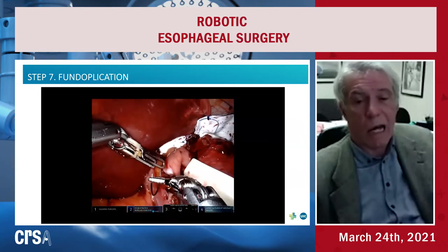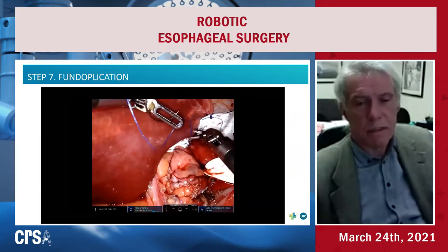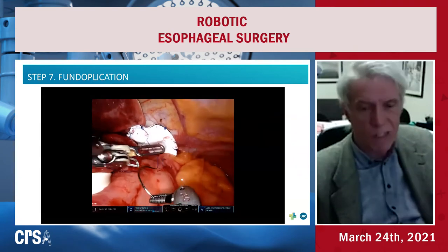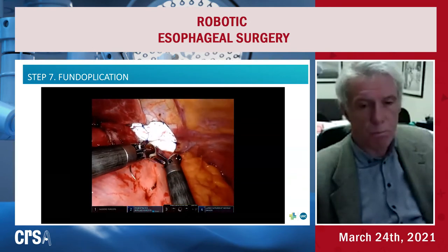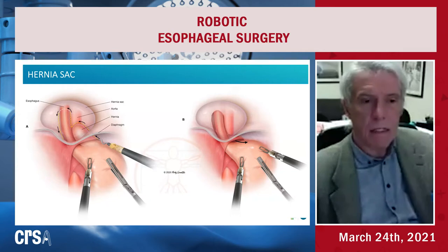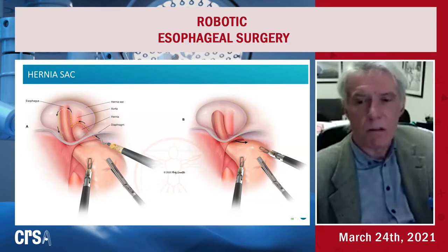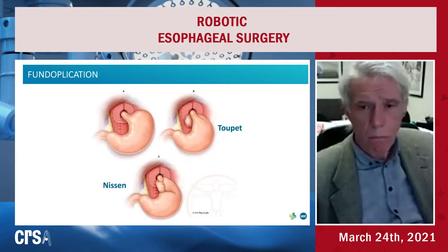The fundoplication not only provides anti-reflux function but also stabilizes the stomach. I don't routinely perform gastropexy — if you have done a nice dissection with complete detachment of the distal esophagus and gastric fundus from the mediastinum, there is no need for gastropexy. The concept is cylindrical detachment starting from the left side in anti-clockwise fashion — left mediastinum, then right side, cylindrical detachment of the hernia sac, and complete reduction of the stomach and esophagus into the abdomen.